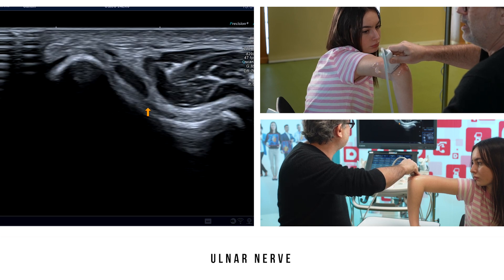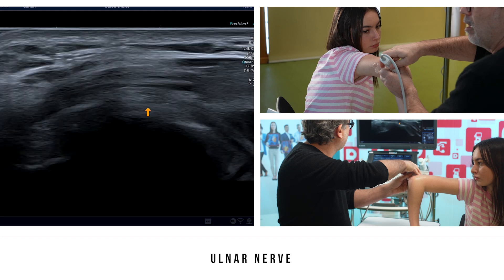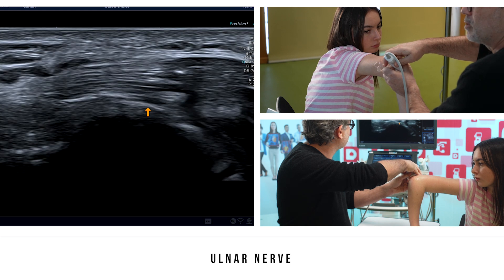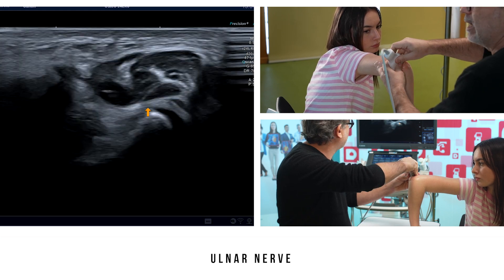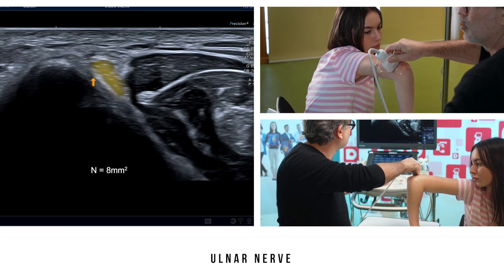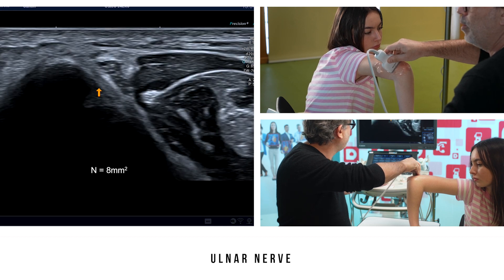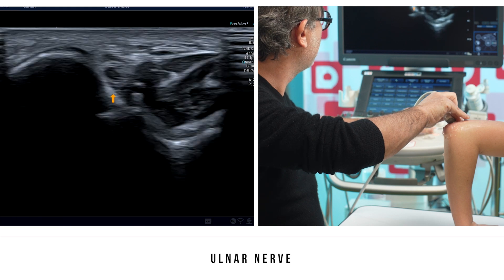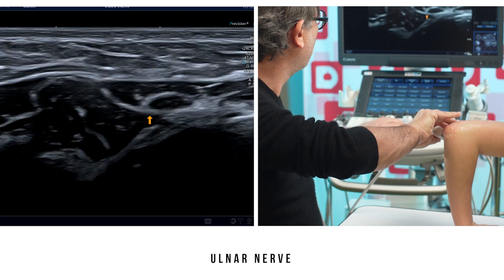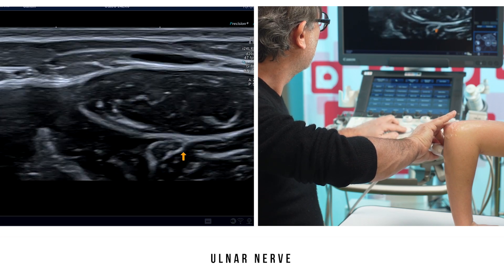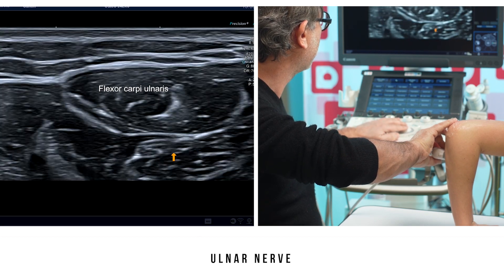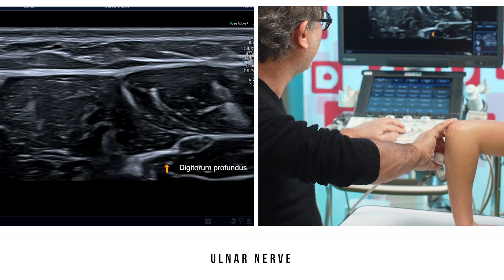If we shift to a sagittal section, we can determine its thickness. On an axial section, the normal ulnar nerve measures about eight square millimeters. Distally, you can follow the nerve to the muscle compartment holding the flexor carpi ulnaris and the flexor digitorum profundus, going to the fourth and fifth digits.